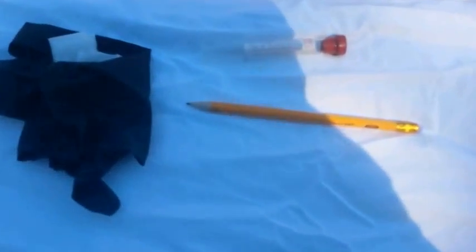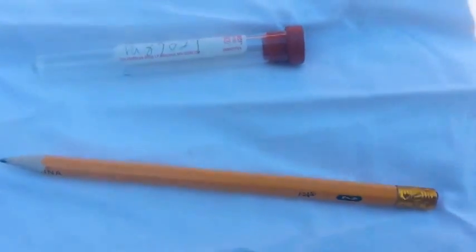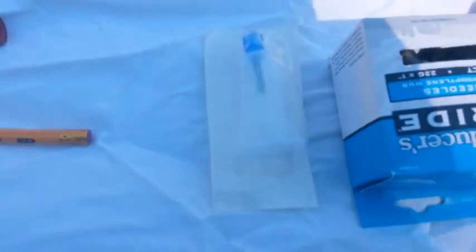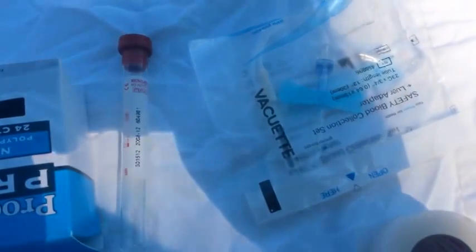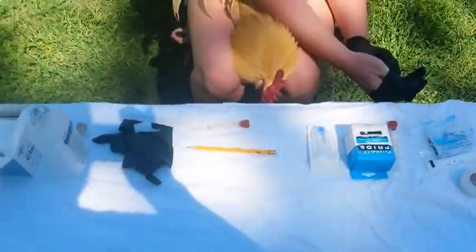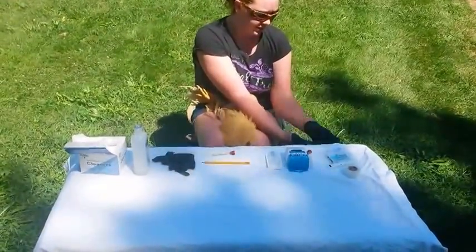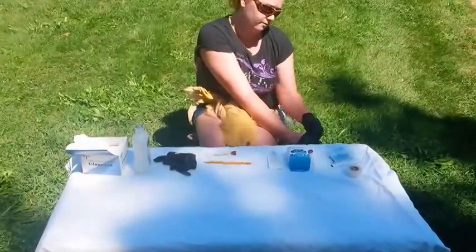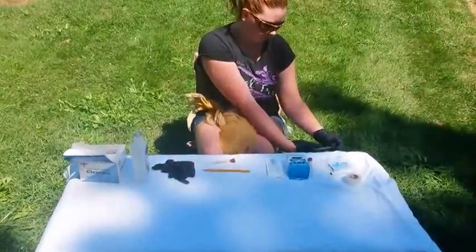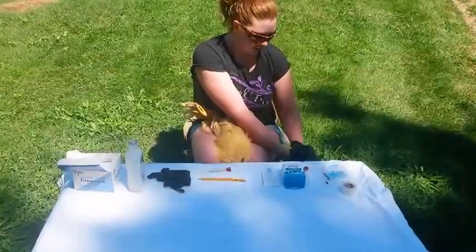I should let my hands dry a little bit. My writing is a little messy on there but it works. We will add into the description down below the video where to buy your products from. It would probably be easier if you let your hands dry a little bit after doing the alcohol.